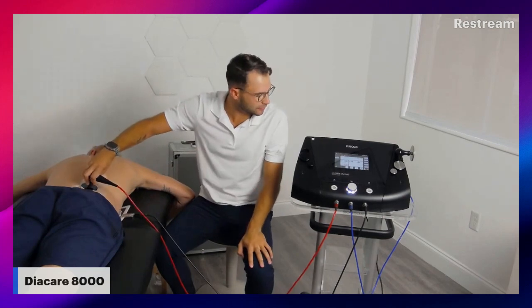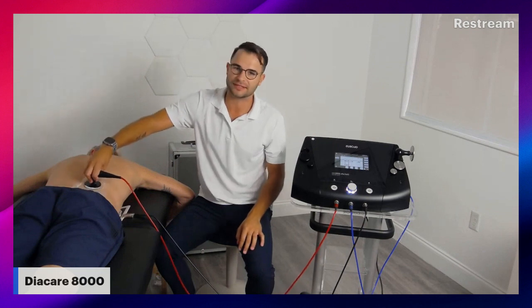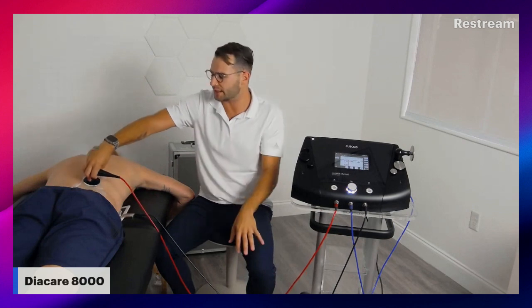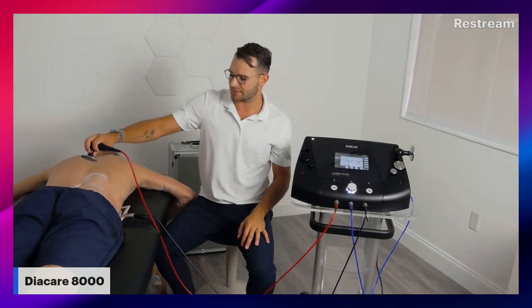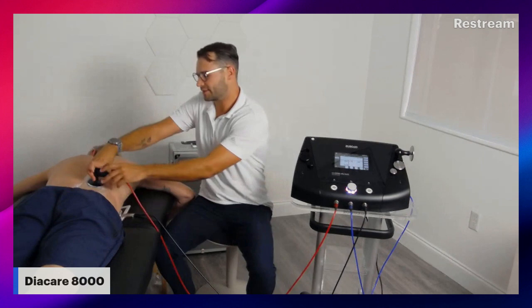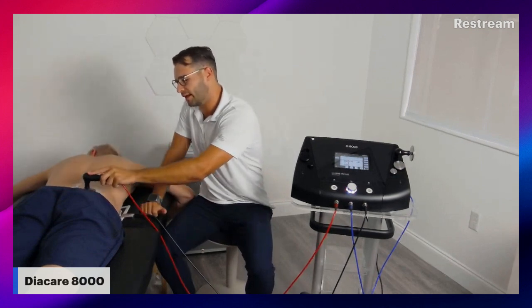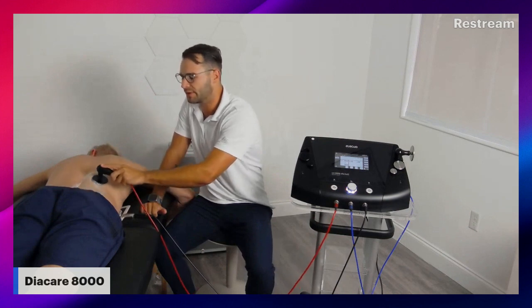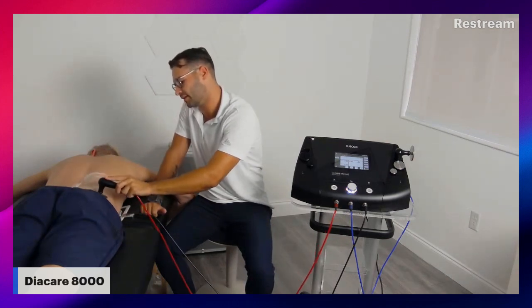You might be hearing a little bit of noise. What you're hearing is if the head of the electrode is getting removed from direct contact with the skin, or you pivot a little bit and it changes on the surface of the skin, you're going to have an audio feedback. So as you can see, if I take it off, you're going to hear that noise. That lets you know that you're not creating great contact, and you can fix the way you're holding the head of the electrode, or figure out if maybe you're not using the correct size head.